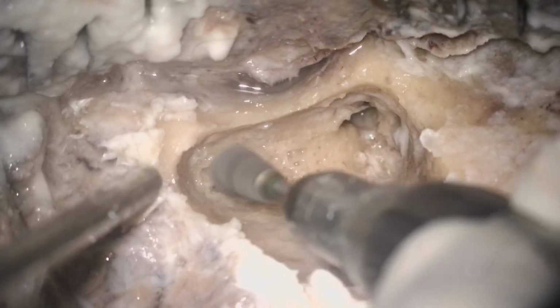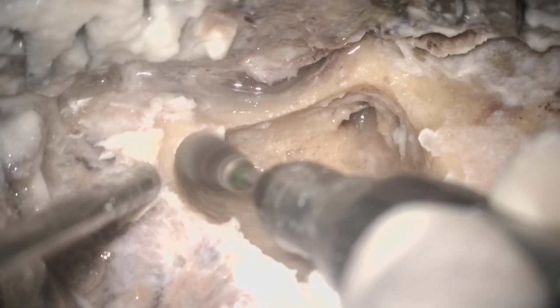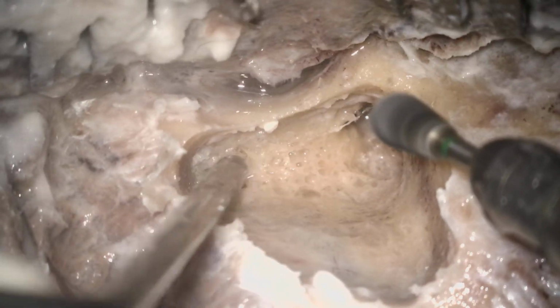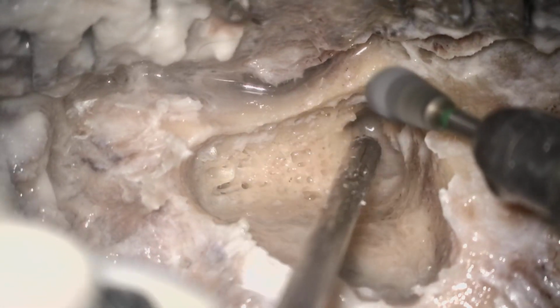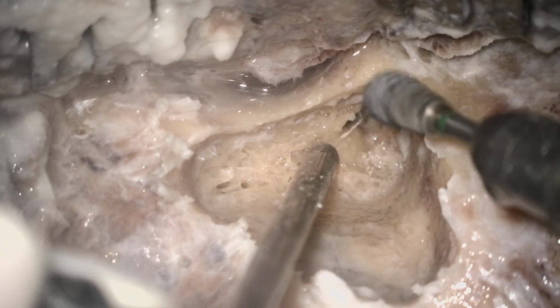So this is the tip cell region we are drilling. This is the actual area of the facial recess, this area. So this is the lateral semicircular canal. You have to go anterior to the lateral semicircular canal.